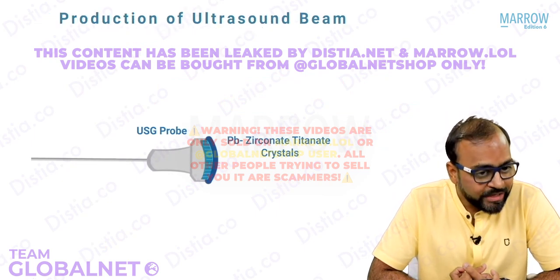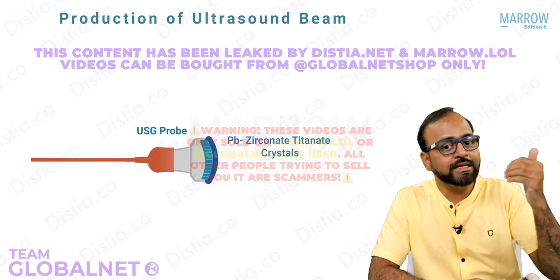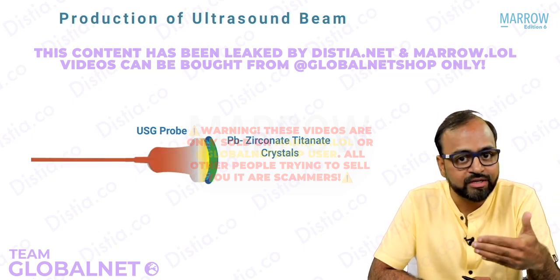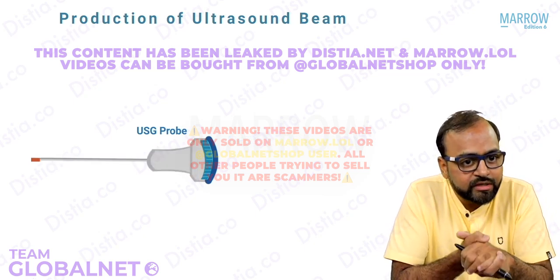Now this ultrasound probe has a wire which is attached to it. Now this wire brings in an electric current to the ultrasound probe. This electric current is passed through the lead zirconate titanate piezoelectric crystals. Now what happens when an electric current is passed through these piezoelectric crystals?